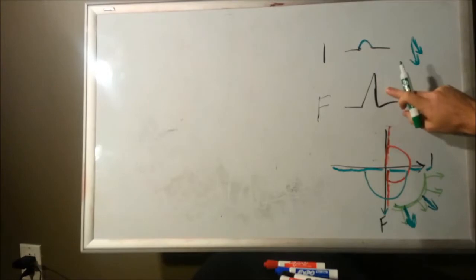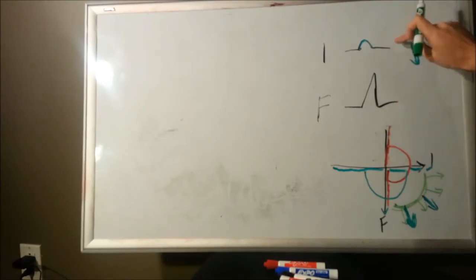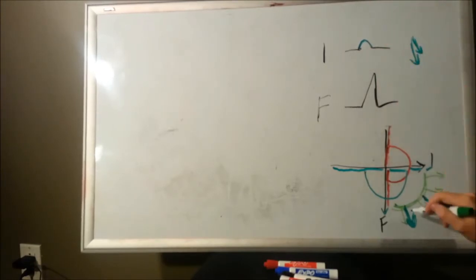Because the closer those arrows are together, so if this is the normal heart, this is AVF, the closer they are together, they'll have a higher deflection. So if 1 is positive and F is positive, but 1 is way lower than F, you know that the vector force of the normal healthy heart is somewhere over there. And then you can use that philosophy with the others, the augmented and the Einthoven leads.